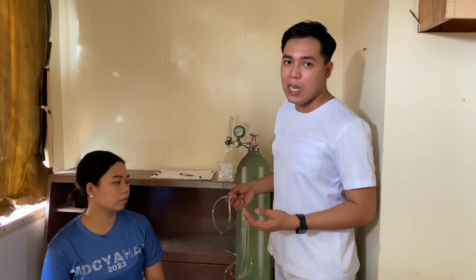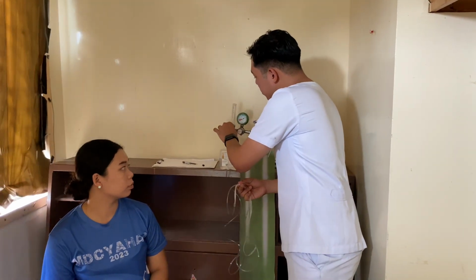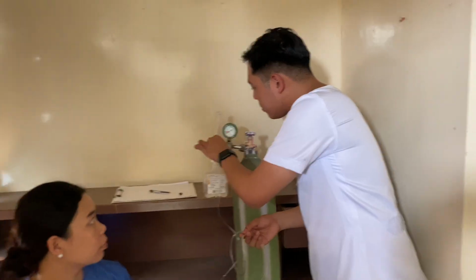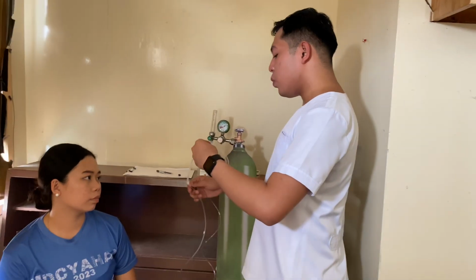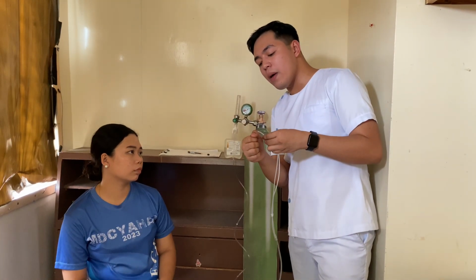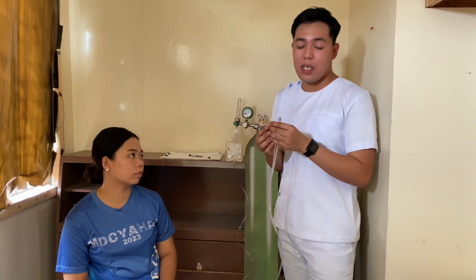If it is prescribed, we set it here. Let's assume that the flow rate is 2 liters per minute. So we set it here. Then, before we give the nasal cannula to the patient, we need to check if there is air already. So how do we check it? It's just like this. Then we place it here to see if air comes out. If there is air, we can place it in the patient's nose.